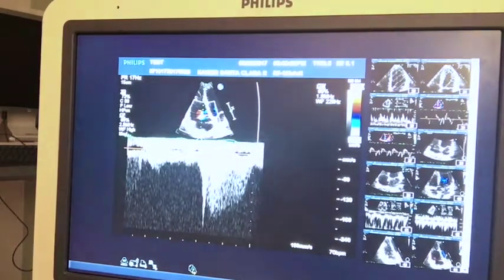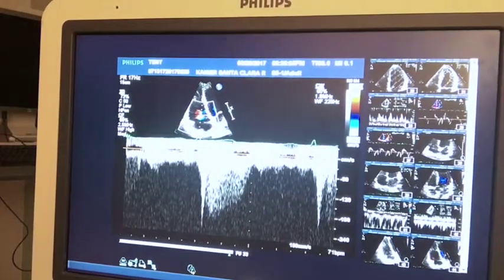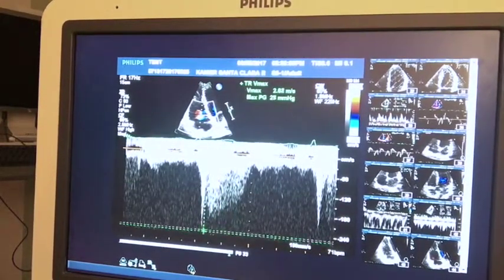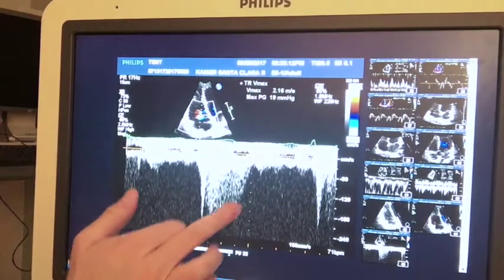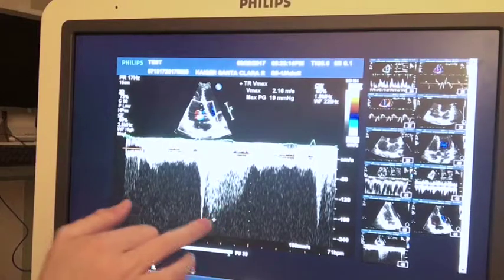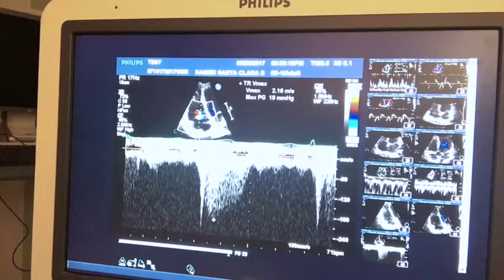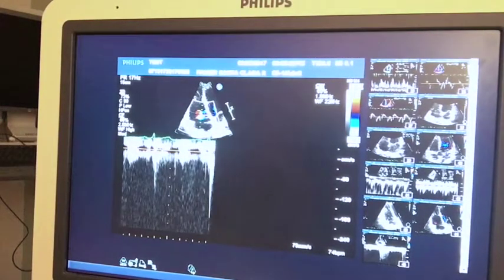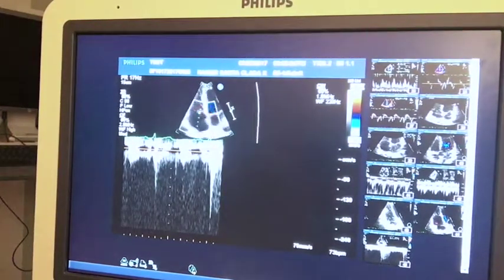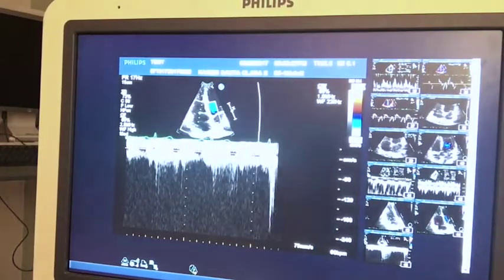when the physician says, what was the RVSP? Okay, make sure that if you can at all do it, do an RVSP, do a reasonable one, make sure that it's a U shape, make sure that it's a reasonable Doppler signal. You can slow it down, you can max it out. You want to show more than one signal on the same screen. That's preferable. So it's preferable to have 3 in a row. If I can get 3 in a row.